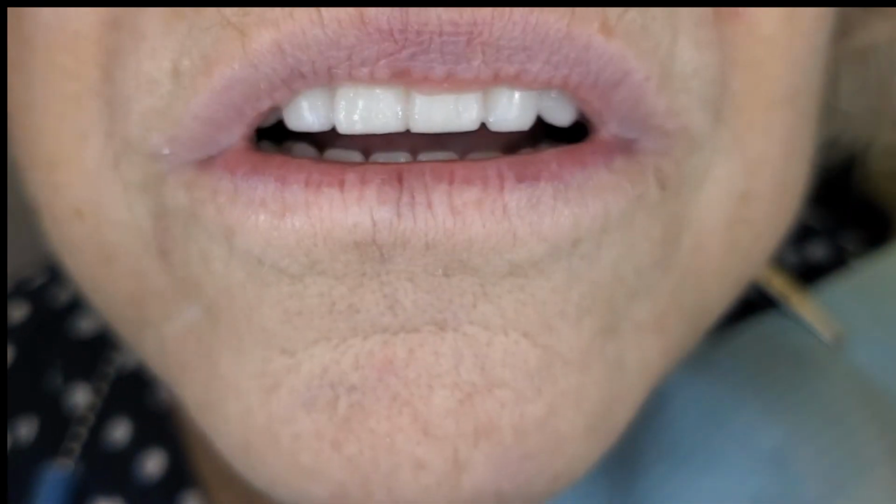So not only did we correct some of the overclosure issues and the sagging muscles, but on that first denture, you could see how well worn down they were, and she had to really mill her food to chew. So during the consultation process, I was talking to her about her chewing, and one of the questions is, why are you here? Well, it's time to get a new denture. Okay, why? What's it like for you? What are you feeling? Oh, it's just harder for me to eat.